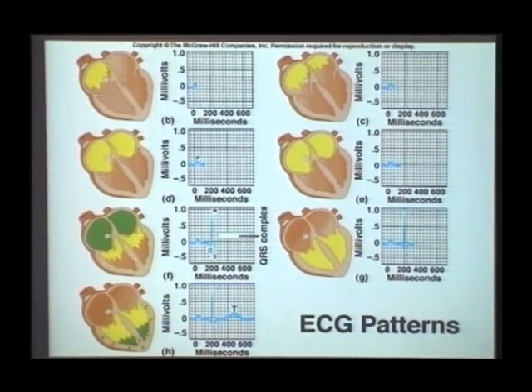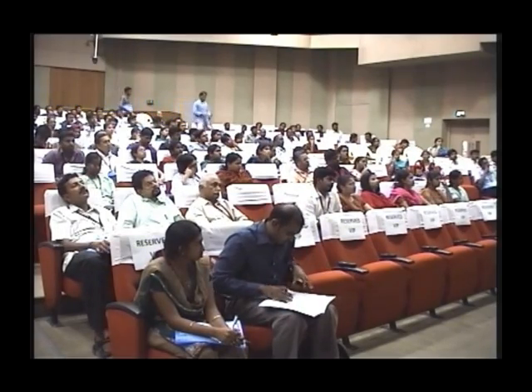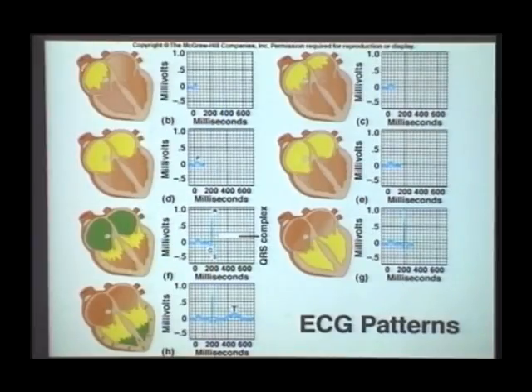Now we are going to see how our PQRST is going to be produced. Now we know what is depolarization, repolarization, and what is happening inside my cell. Now we are going to derive all our PQRST. Once the sinus node produces an impulse, the impulse comes out of the sinus node to first depolarize the atrium. That produces the first wave in the ECG, which is called the P wave.